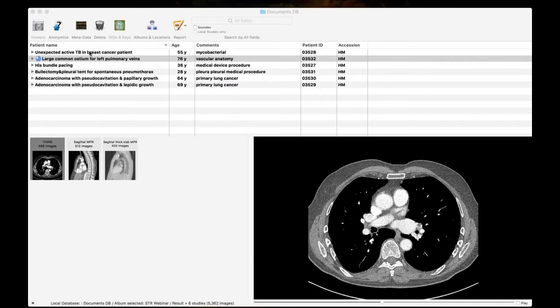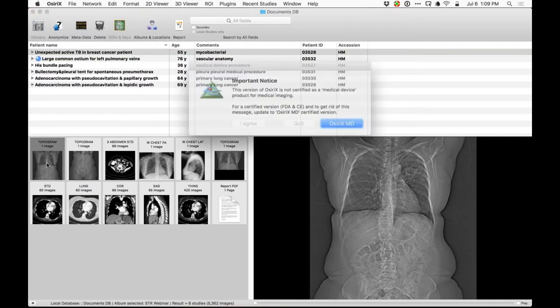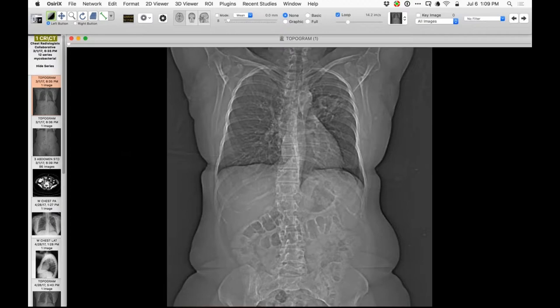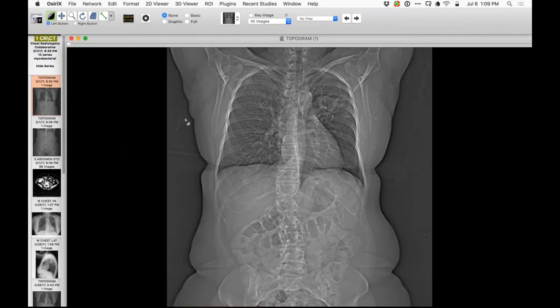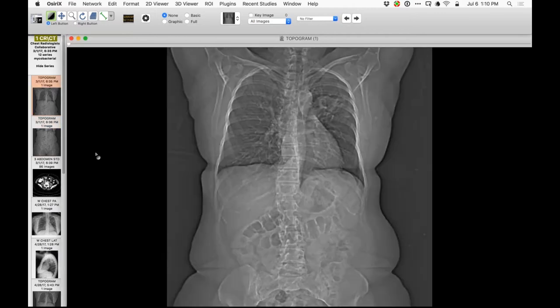Let me start with this one - a lady with a history of breast cancer. When they did the abdominal CT in March, for a reason I cannot fathom, they had a scout image that included the whole chest. Usually of course the scout image looks different, but this lesion here, which was not present on the axial images, was not seen. It's a reminder to more carefully look at the scout images on CT - I forget to do that, but this is a good reminder.